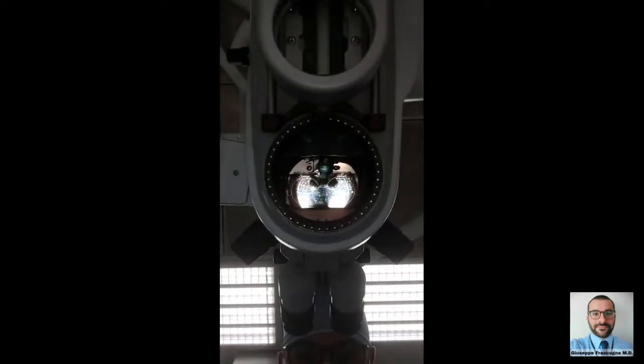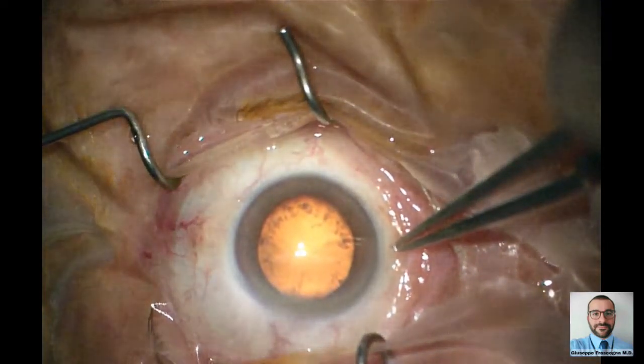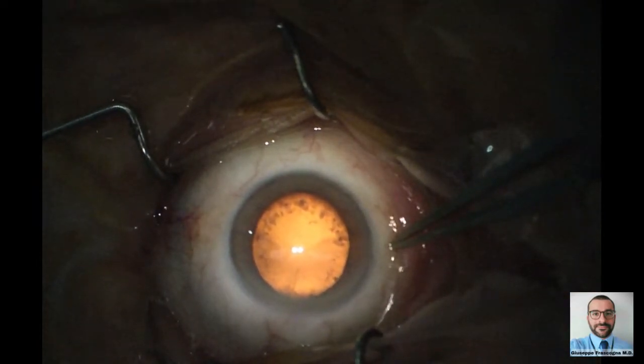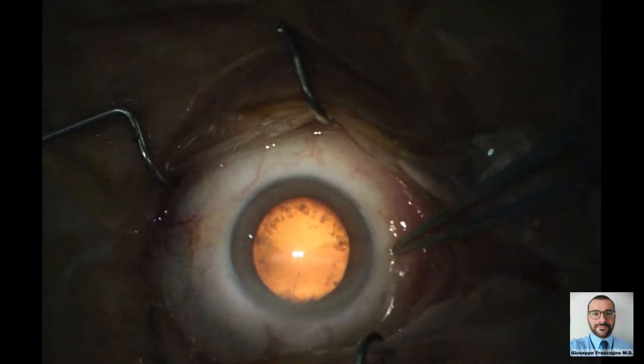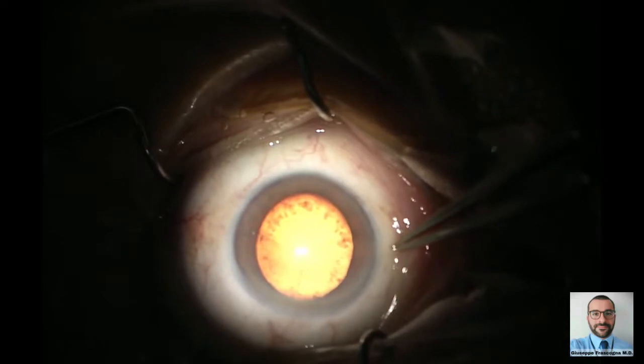The microscope has two types of illumination: coaxial light and oblique light. The coaxial light follows the eyepiece axis almost perfectly — it illuminates the center of the field for 20 mm in diameter. It helps to get the red reflex in backlighting, a crucial feature during the capsulorrhexis, the cortical masses removal, and the IOL positioning.